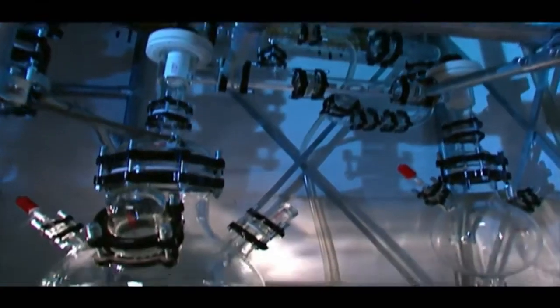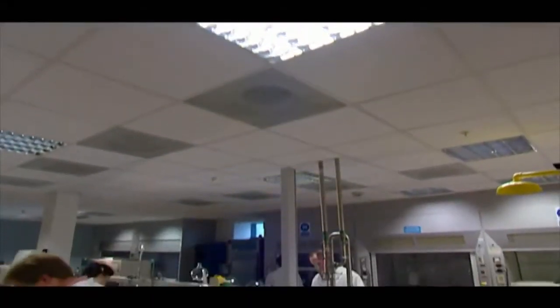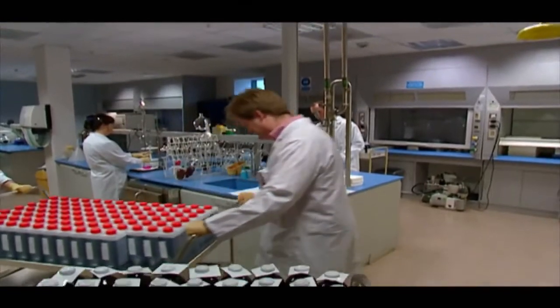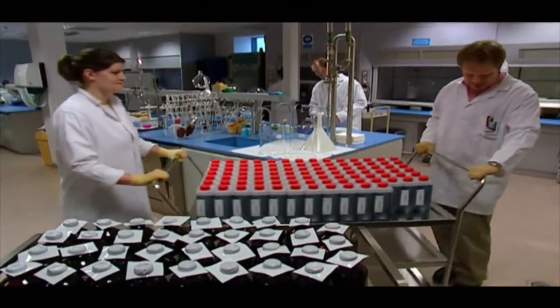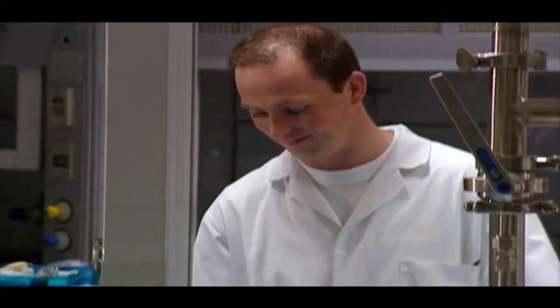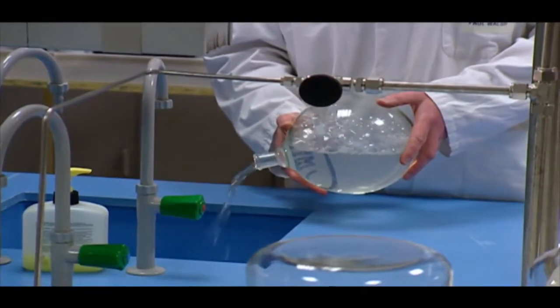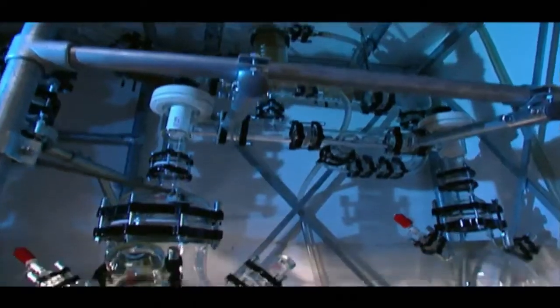Manufacturing a contact lens starts in the lab. These bottles contain the ingredients from which contact lenses are cooked. They're a kind of liquid plastic called acrylic. Acrylic is pretty strong stuff. A little goes a long way. We get about 25,000 contact lenses from each of these bottles.